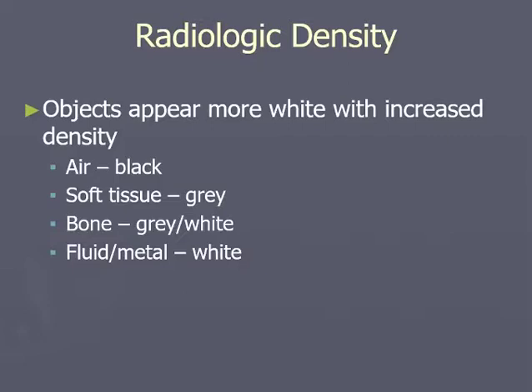So let's talk a little bit more about what a chest x-ray is all about. I always like to think of a chest x-ray as a 2-dimensional image of a 3-dimensional object. You can think of it like shadow puppets. You put your hand up, you have a light source, and on the wall you can see a shadow. That's what you're seeing with a chest x-ray. You are seeing a shadow, but instead of using a flashlight, you're actually using an x-ray source.